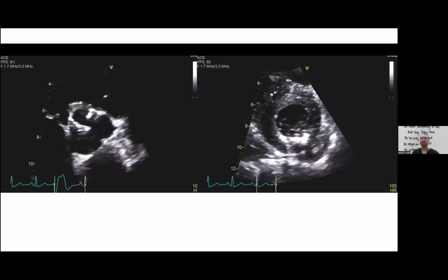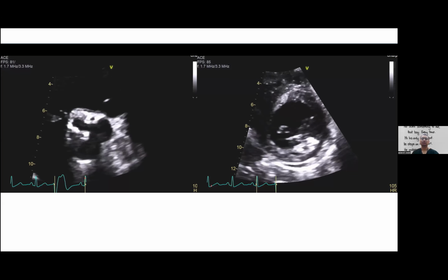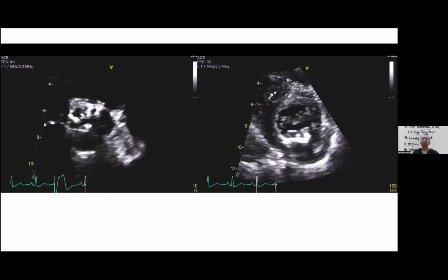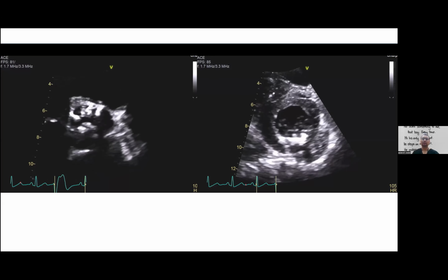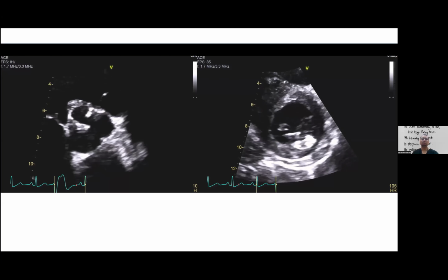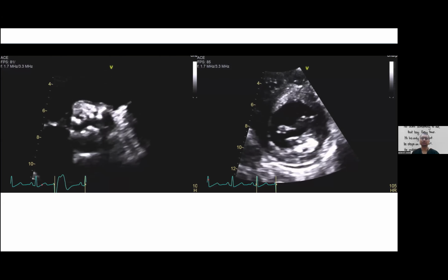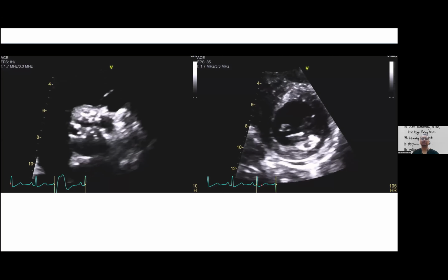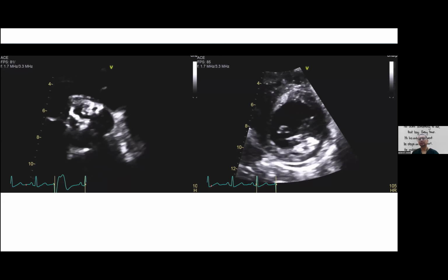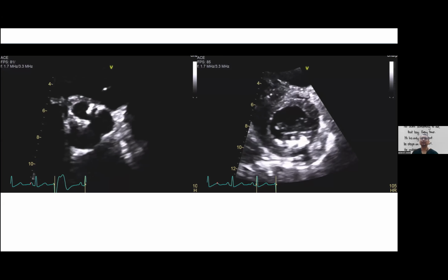A patient with a history of radiation, if they come with failure symptoms, say pedal edema, raised jugular venous pressure, Kussmaul sign, ascites, but the echo shows preserved ejection fraction with respirophasic septal shift and beat to beat septal shudder, that is an indication of constrictive pericarditis.